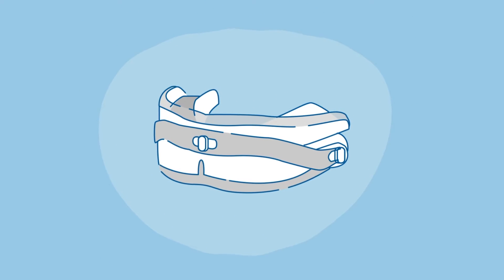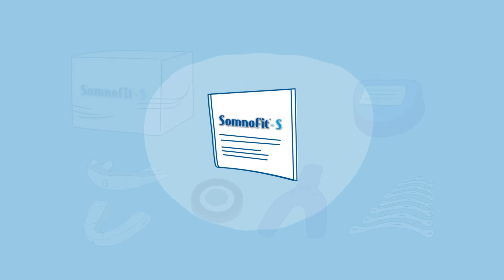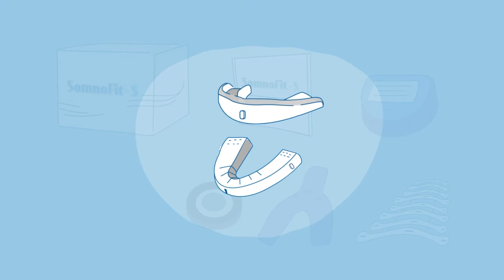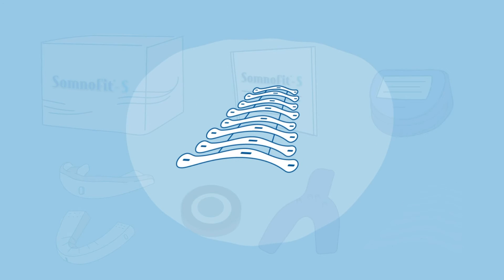Thank you for purchasing the SomnoFit-S Mandibular Advancement Device. Here's the user's guide. The package contains the following items: instructions for use, a ventilated storage box, two splints — one upper, one lower — a water temperature indicator, an impression board, and a set of flexible strips.